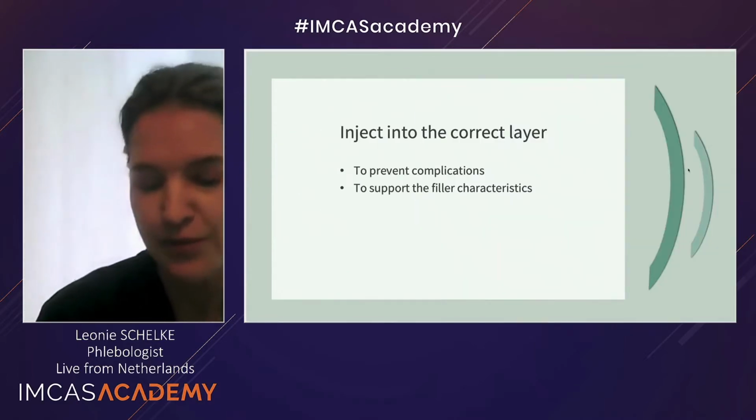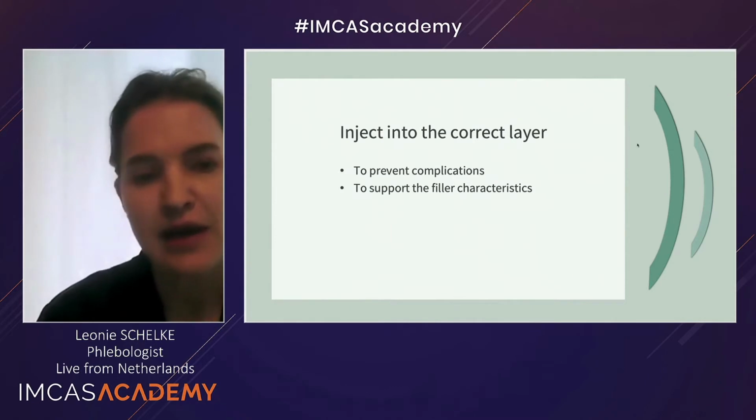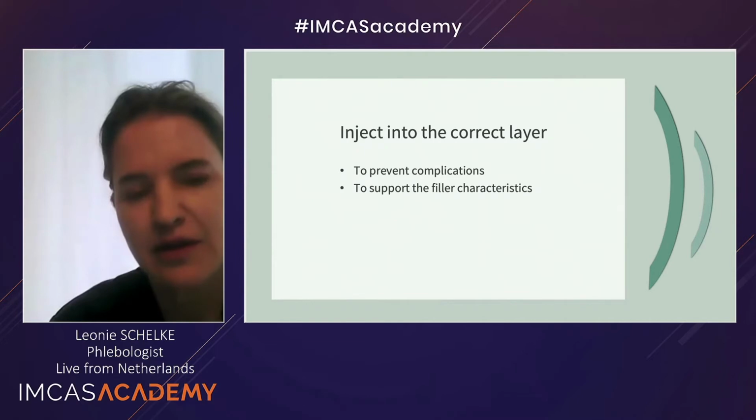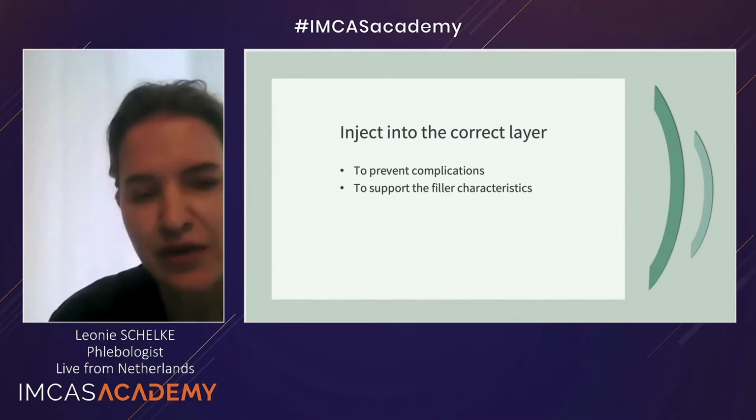And if you want to prevent complications, this is very important. Inject into the correct layer, but not only to prevent them, but also to get the maximum effect out of the filler that you're using.